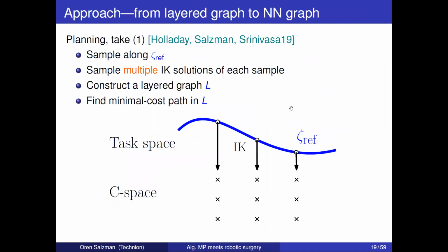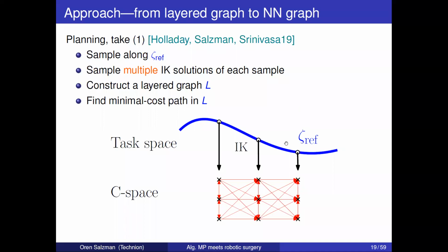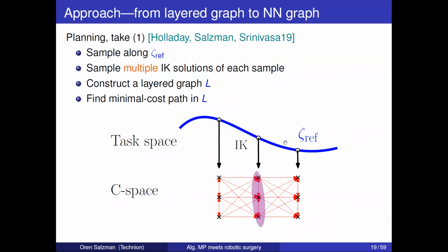What this means in our algorithm is that we may have a reference layer that is completely blocked. So no matter how much we incrementally densify it, we're just going to add more and more points and more layers, but we're forcing our algorithm to pass through each one of these layers, and it's never going to be able to bypass a layer that's completely in collision. And we realized this only when we came to apply this algorithm to this domain.